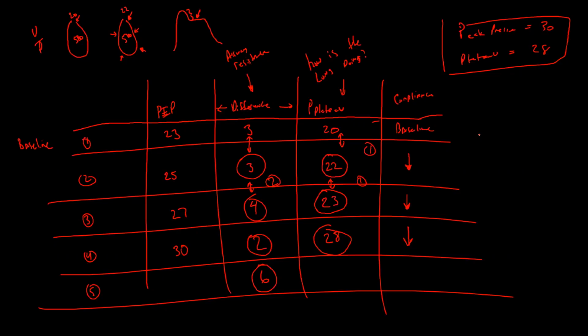So basically, if we just remember the note that you put up here, the plateau is how well the lung is doing, and then the airway resistance is the difference between the two numbers, we can pretty much answer the question? Yes. Okay. And there's several questions, but they're all written in different terms.